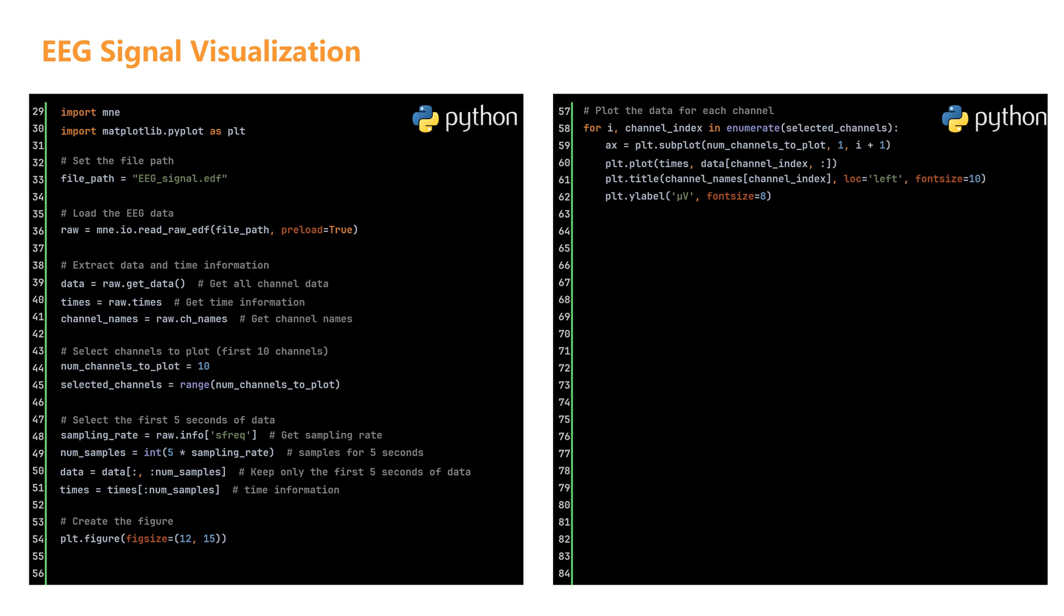Add a title showing the channel name with title. Label the y-axis with microvolts to indicate the unit of measurement. After we have created all 10 subplots, we add a label to the x-axis showing time in seconds. We then call tight_layout to automatically adjust the spacing between our subplots. This prevents any overlapping between titles, labels, and the plots themselves.